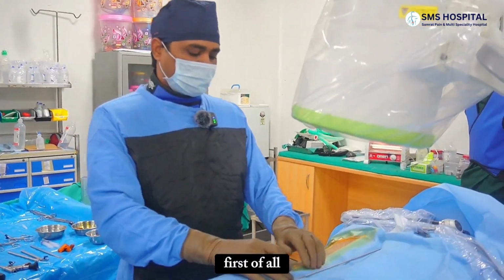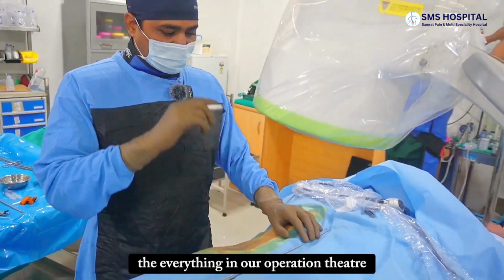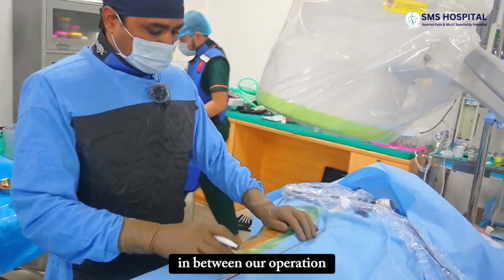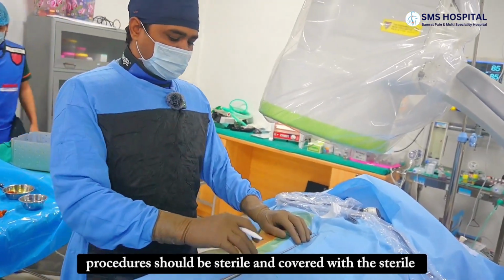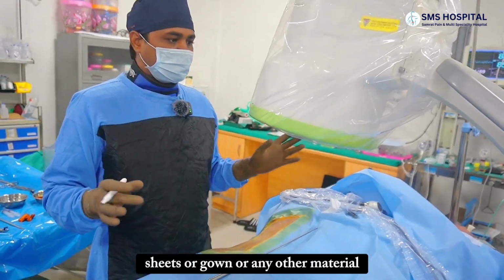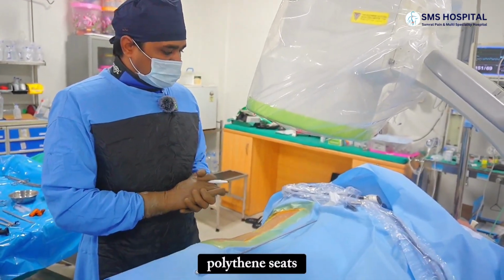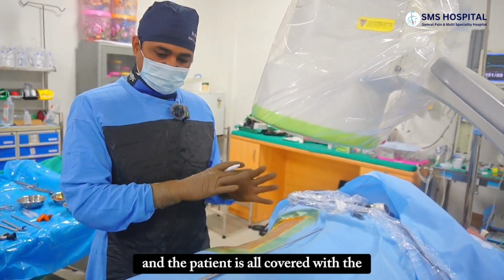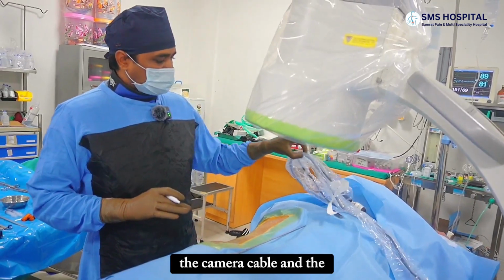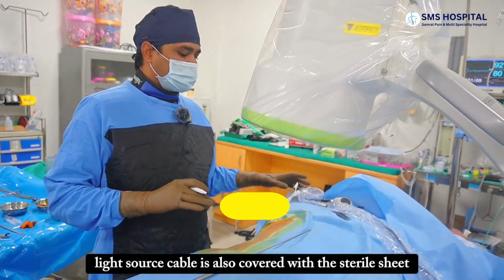First of all, the most important thing is that everything in our operation theater that comes in during our operation procedure should be sterile and covered with sterile sheets or gown or any other material. This is the C-arm covered with a sterile polythene sheet, and the patient is wholly covered with the spine scrub. The camera cable and the light source cable are also covered with a sterile sheet.